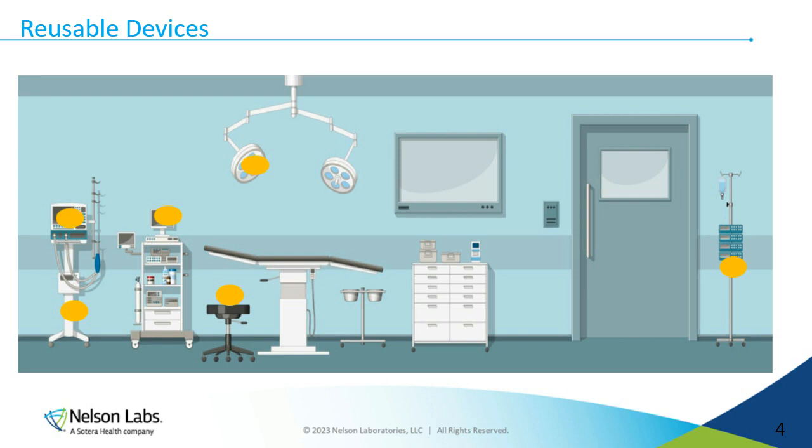And so hospital practice is now being challenged with IFUs, instructions for use, for medical devices in their facility, to ask manufacturers, do we have instructions for use for this? Because now we're being asked by the Joint Commission, or when we're being audited, what are the instructions for use for these types of devices? Now you might see that there's a light, a huge light, and these lights, I mean, the picture doesn't do justice.